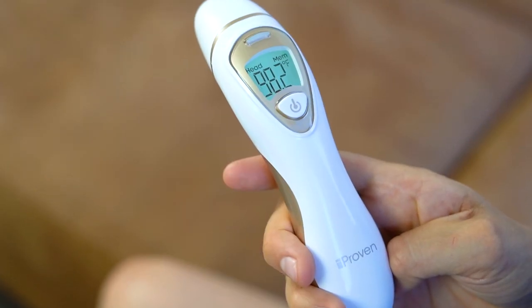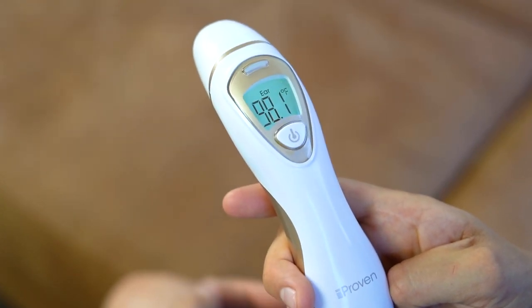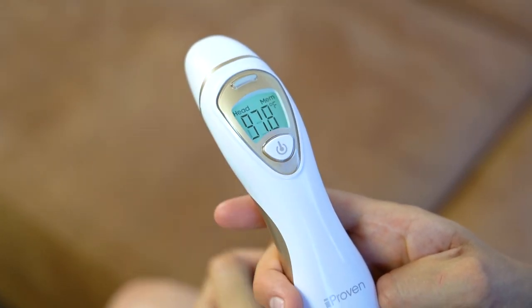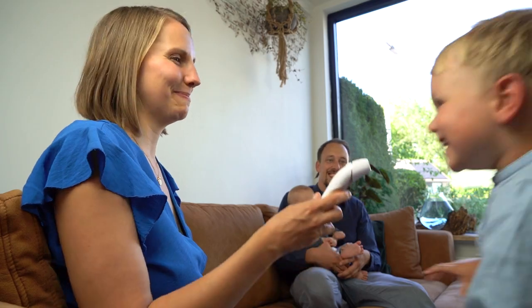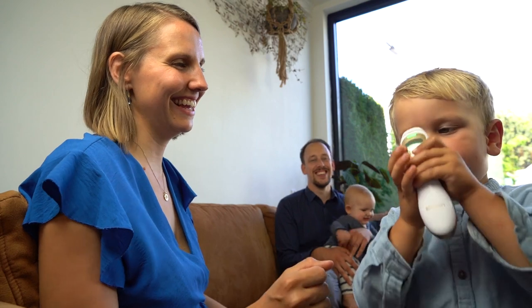The colored light is also a memory button. Press it to check your last result and press it again to see the result before that. It can store up to 20 measurements. Perfect for your whole family.